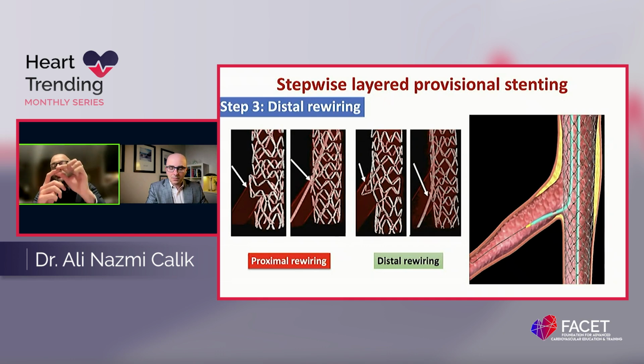We have to give, let's say, this is the first angle. We have to just put a second angle like this. And this distance should be the same as the main vessel proximal diameter. Let's say if our main vessel proximal is 3.0, from the second angle to the tip of the guide wire should be 3 millimeters. So it will allow you to go through the distal strut easily.